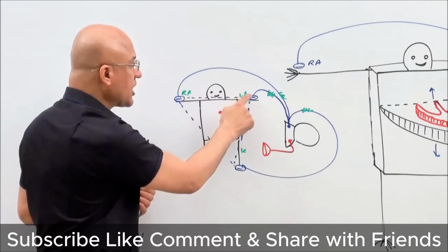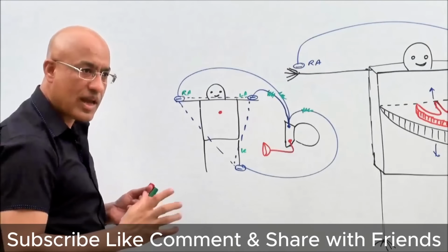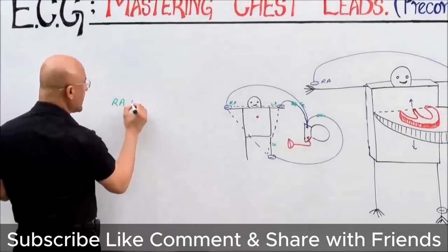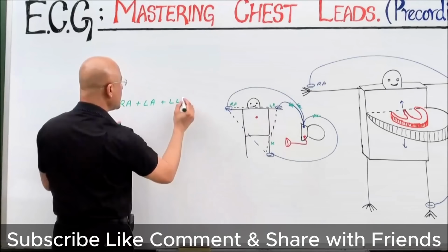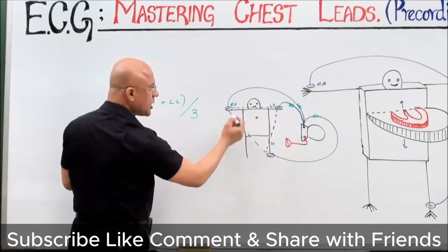So all the potentials, right, are added together. It means the potential from the right arm plus the potential from the left arm plus the potential from the left leg, and all of them divided by 3, because we average them.